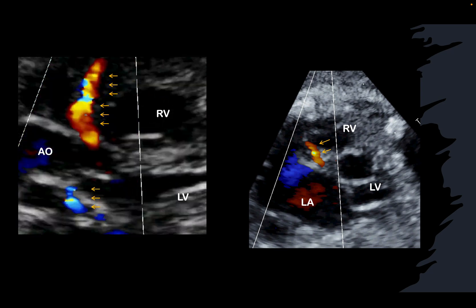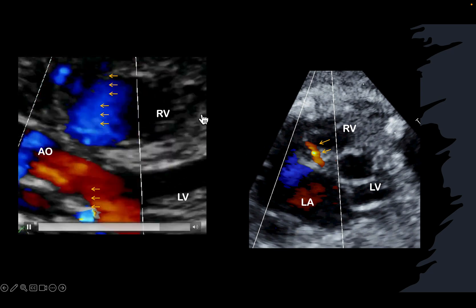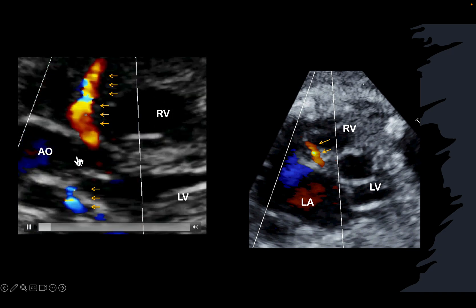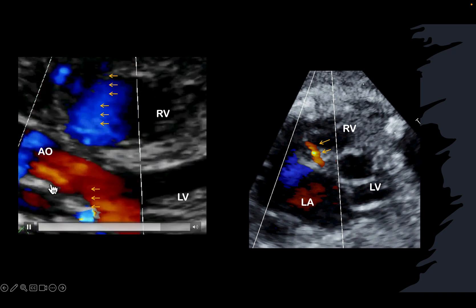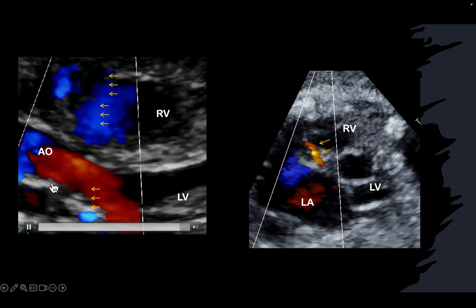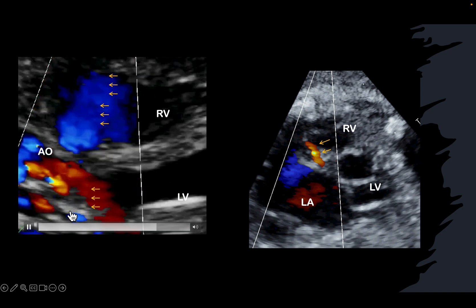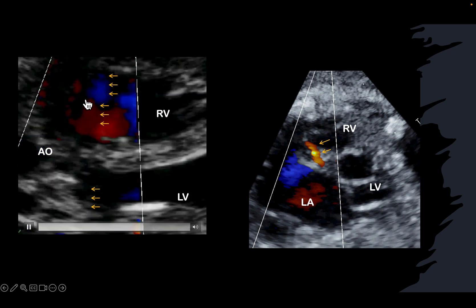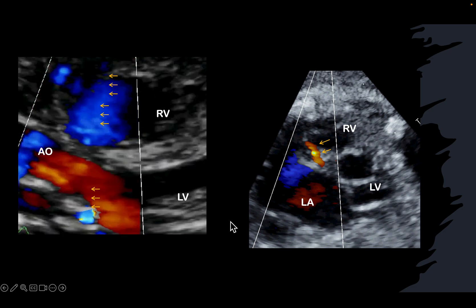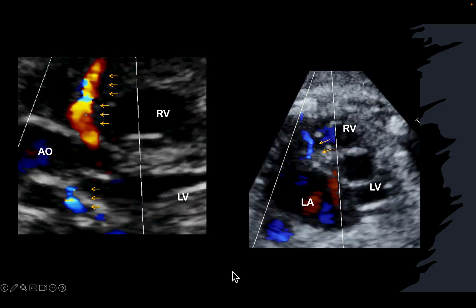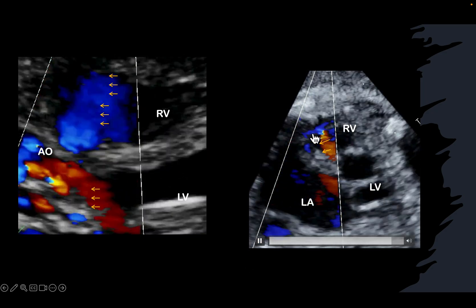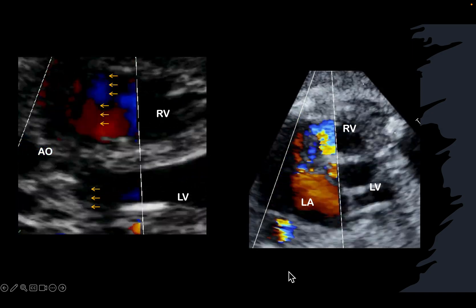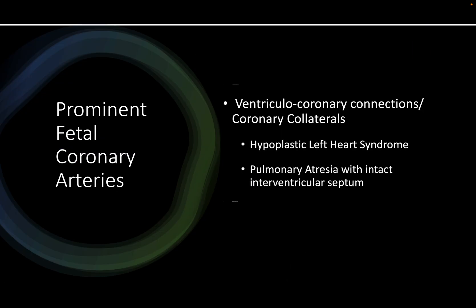When the coronary arteries are dilated you can see them. To orient you: this is the right ventricle, left ventricle, and the aortic valve. You can see the left coronary artery with blood flow going in one direction shown in blue, and the right coronary artery coming towards the transducer is quite big — about a third the size of the aorta. In another patient you see a prominent right coronary artery, and a prominent coronary artery indicates something stressful is happening to the fetus.